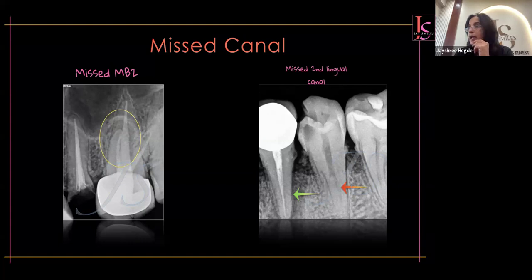And you can see the green arrow, that is 3-4, so much bone loss that the tooth was almost grade 2 mobility. And if you look at the red arrow, that is 3-5, you can see that there are 2 canals. I'm sure you can appreciate that you have a large canal bifurcating into 2, so this red arrow indicates 2 canals in 3-5.